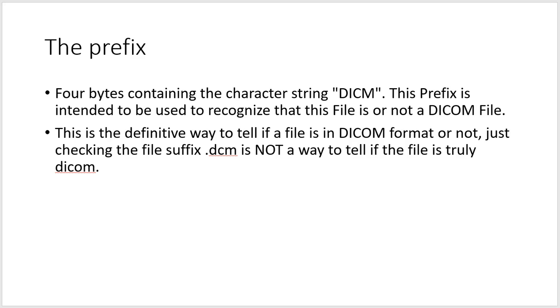So a patient brings a CD and it ends up in your office and you put it in. It has some images on it and they are .jpeg. If they're JPEGs, they're not DICOM. But what if they're .dcm? It's pretty easy to just backspace out the .jpeg and change it to be .dcm. Did that magically make it a DICOM file?